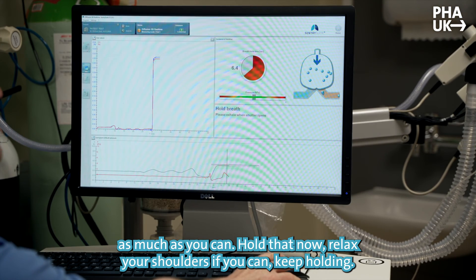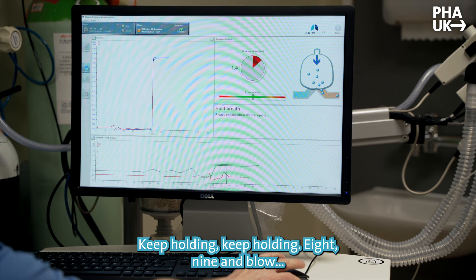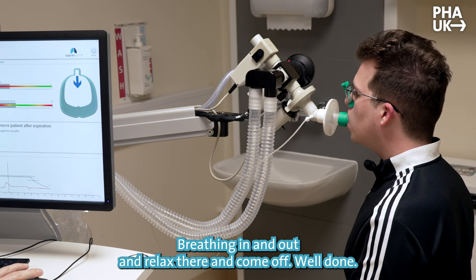Relax your shoulders if you can. Keep holding... eight... nine... and blow. Keep it going, keep blowing. Going back to normal breathing in and out.